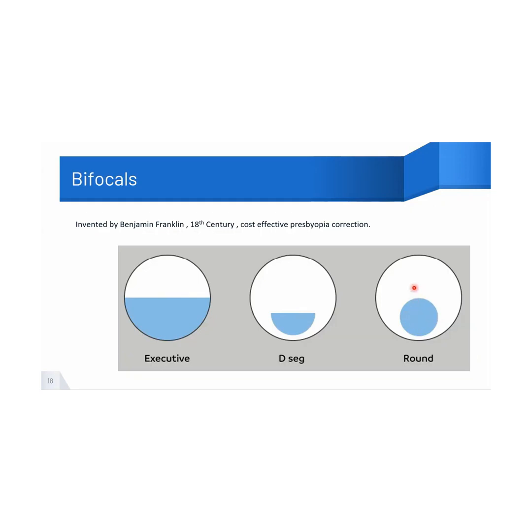Okay. Now to keep it very simple as a concept, not getting confused, you have to just keep in your mind the overall distance between the optic center of distance and near zone. Now, longer this distance, greater the image jump. Shorter the distance, lesser the image jump. Okay. So this one from here to here. This one from here to here, and this one from here to here.